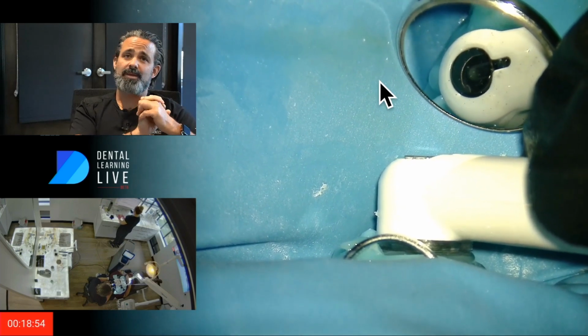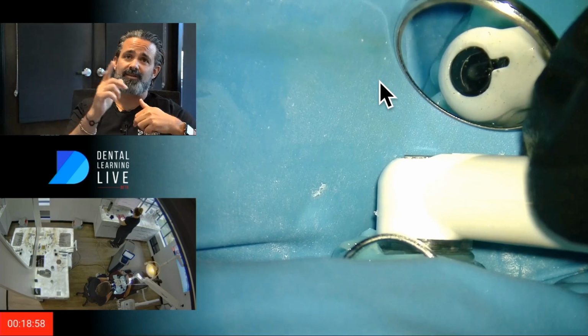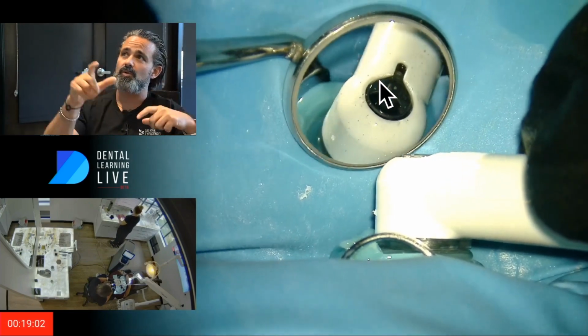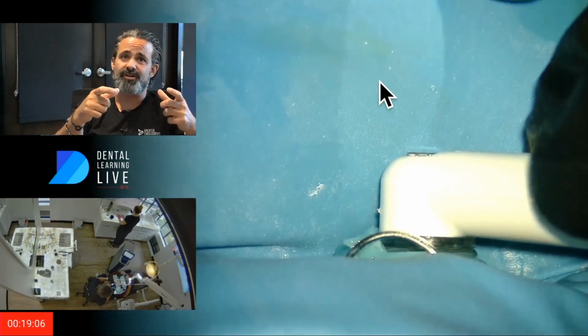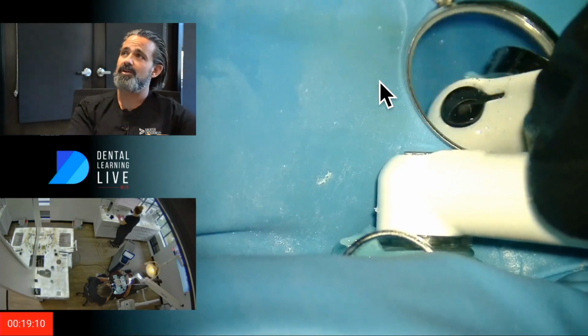I know a lot of people talk about perhaps having their staff do it, and they feel very comfortable having them do this, more so in the molar. And I think maybe it's because there's a little bit more wiggle room when you have that silicone. It just seems squishier, and it seems like you can have a lot more wiggle room on that, and that might be why you're more comfortable with it.